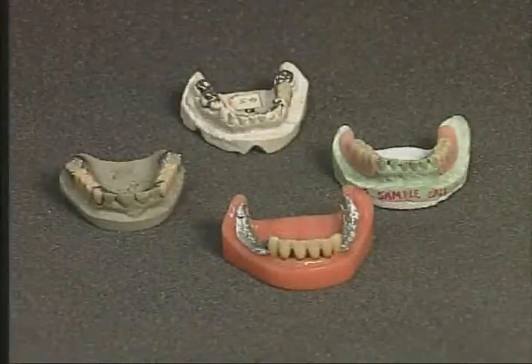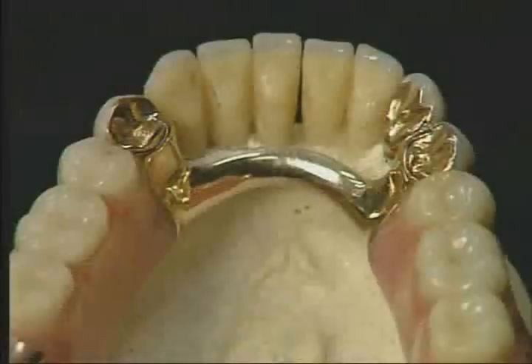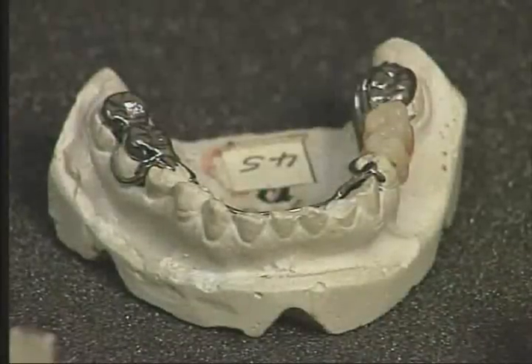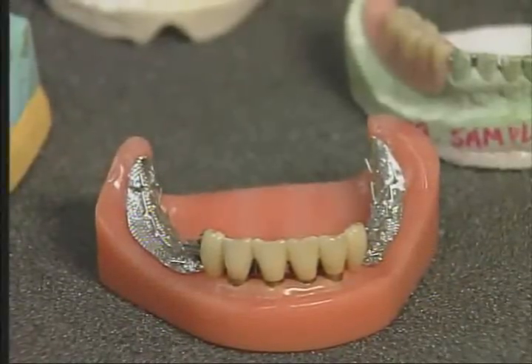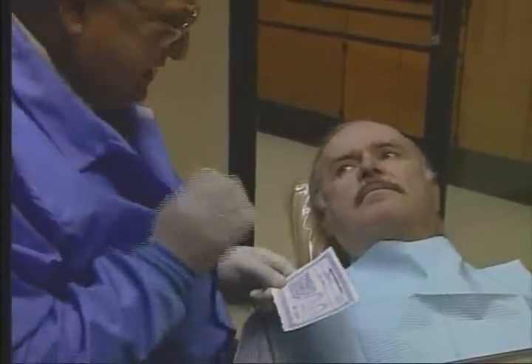The Equipoise proven partial denture system is designed to handle all of your removable partial needs. It is a simple, easy, proven system that can be used with many different applications. The Equipoise CNL Precision Partial is the only available system that can be incorporated with a single crown. The retention L-spring is universal in size and shape and easily replaced chairside. Equipoise partials are an excellent way to do your TMD cases and can also be used with implants to provide a successful alternative to your fixed or over-denture cases. Most of all, Equipoise partials are good for your patients. Your patients will be satisfied customers who will help bring referrals to your practice. In order to ensure that you have a genuinely designed Equipoise case, make sure you use only Equipoise certified dental laboratories and receive an Equipoise certificate of authenticity with each case.